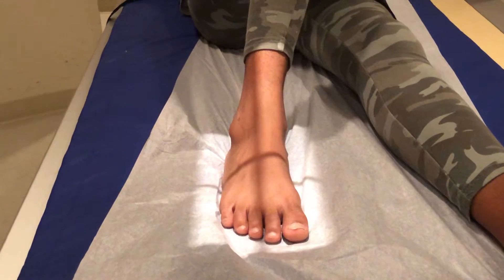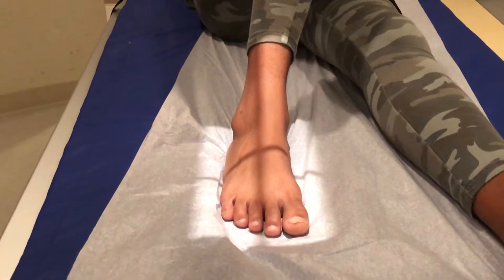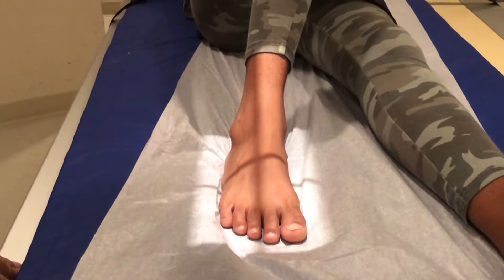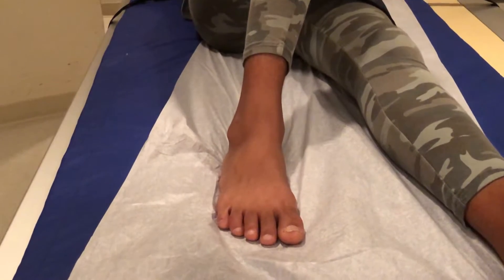Hi, you clicked on this link because you want to know how to take an x-ray of the foot and I'm going to show you how to do it perfectly every time. This is an examination of the foot and it requires three views: an AP, oblique, and a lateral, and I'm going to show you how to do all three of them.